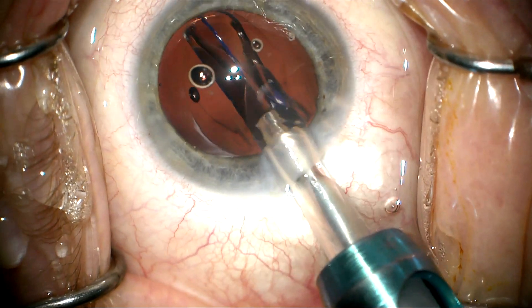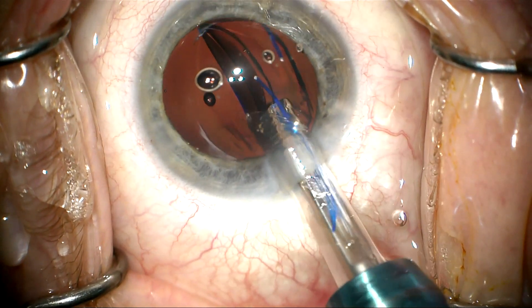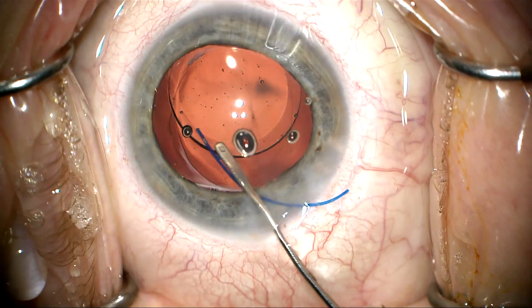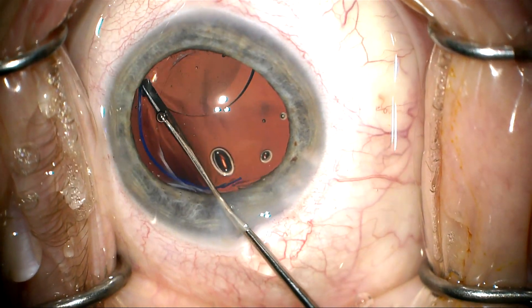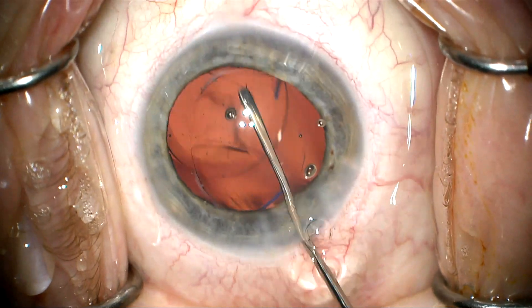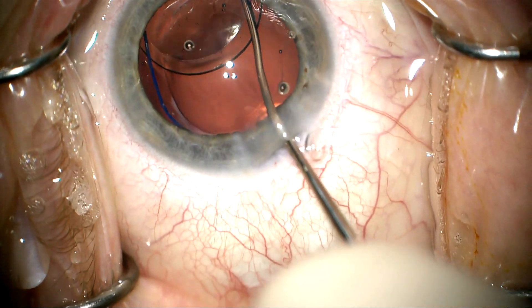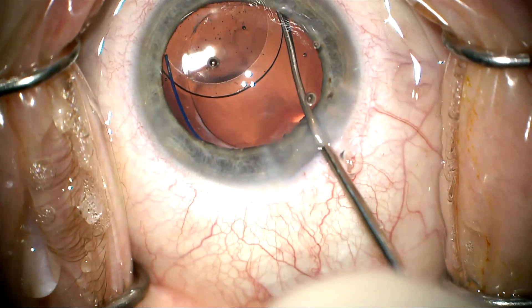I'm going to go ahead and place a three-piece Zeiss CT Lucia lens in the capsular bag and see how that centers. Now I'm rotating this into the bag, and I notice that the posterior capsule is very loose and floppy, and the lens de-centers within the bag a bit.